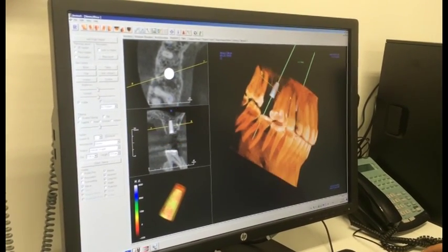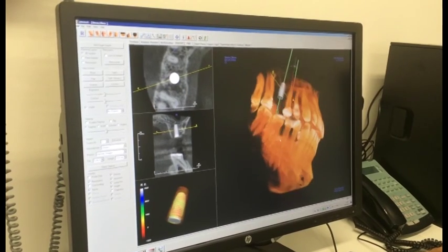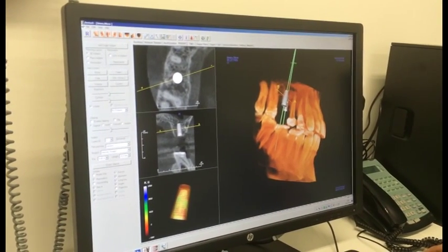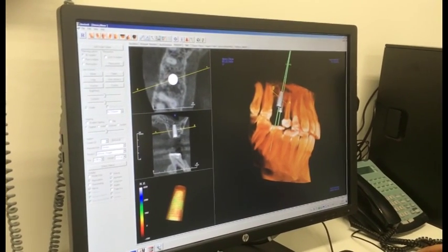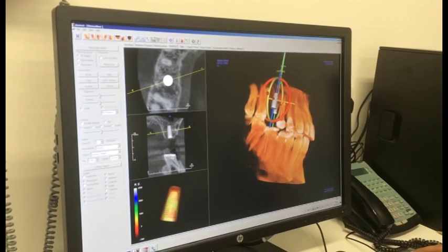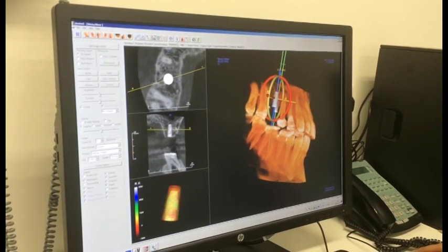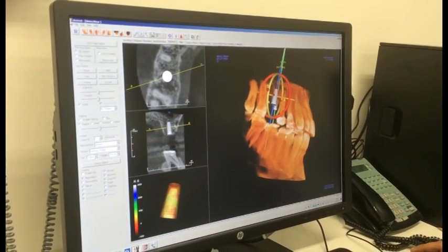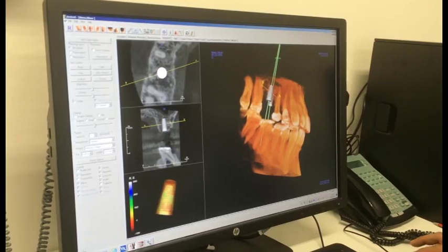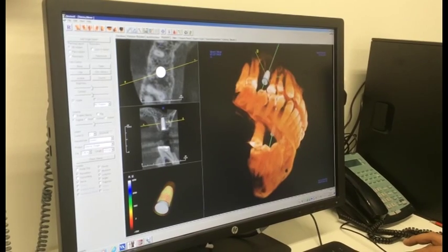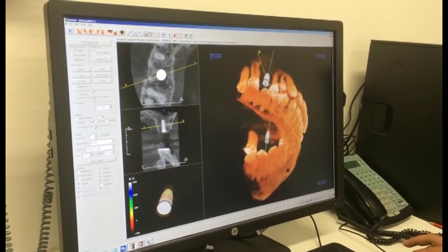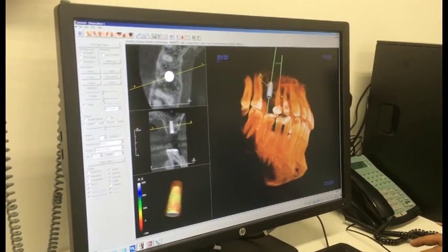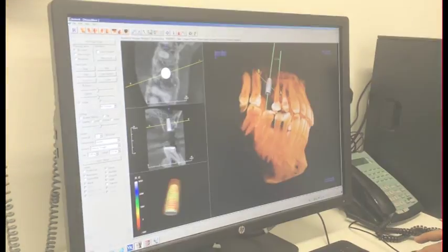We can check it in three dimensions, make sure it's not hitting any root. We can turn the implant in different directions and angulations. Basically, it's precision in where you are placing the implant. And if there is a bone pathology, you can pick that up as well.